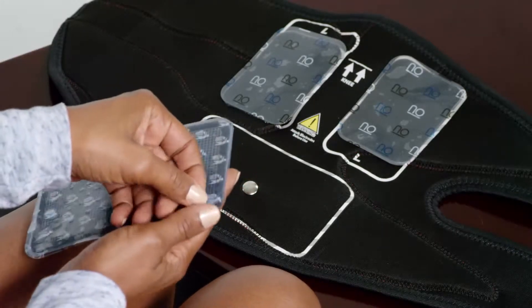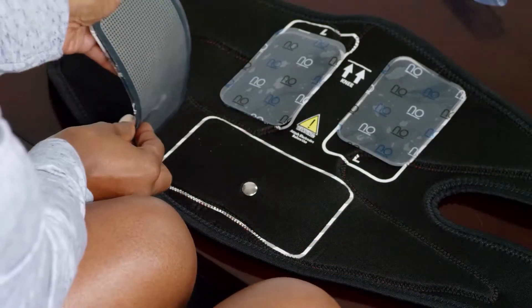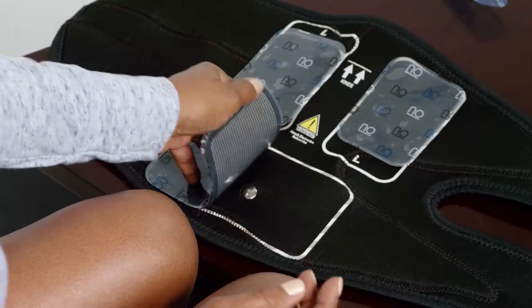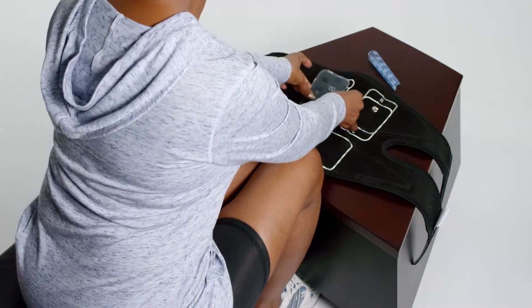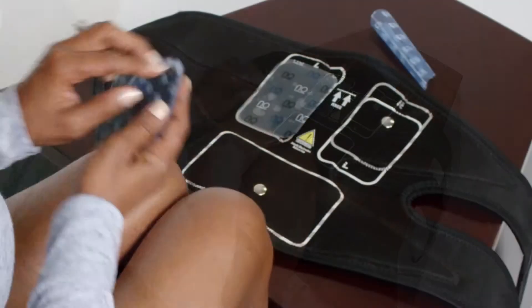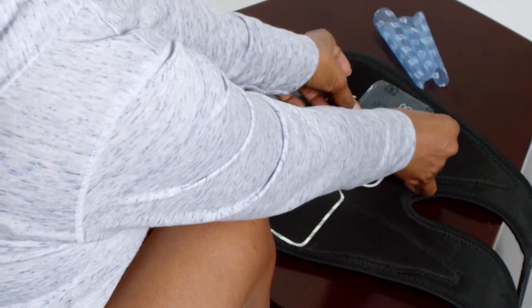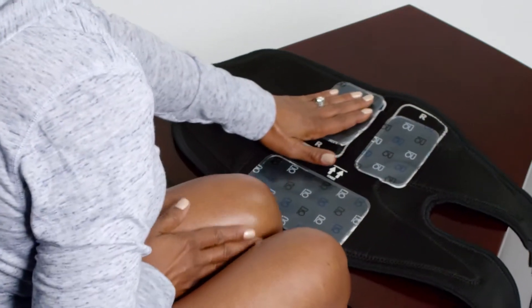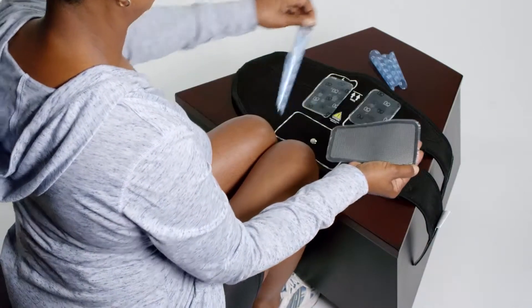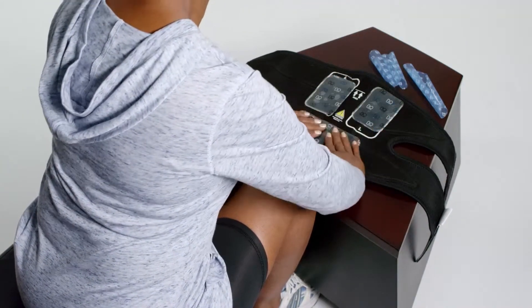Lay the garment face down on a flat surface with the metal studs facing up. Remove the thin blue plastic liner on the grid side of the electrode and dispose of the liner. Place the electrode's grid side down within the proper outline of the garment. Press down firmly to ensure the electrode adheres. If you are using the garment to treat your right leg, place the two smaller electrodes in the gray outlines labeled right electrode placement. For both the right and left leg treatment, place the larger electrode within the larger gray-white dashed outline. You should always use all three electrodes on the garment.